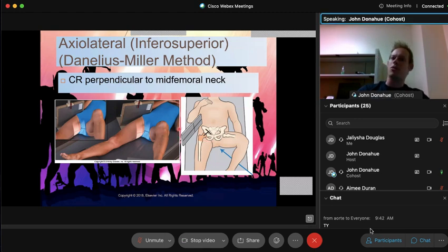I'll put a lead jacket on them and ask them to hold that leg out of the way for me. The more that leg's out of the way, the more clear a view you're going to get of that joint space, the more you're going to get that right on the money. Now, probably the biggest mistake people make is they start messing with their tube versus cassette. They forget to line the tube up to the cassette and they miss the anatomy.